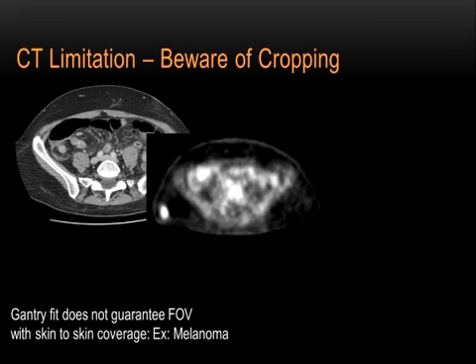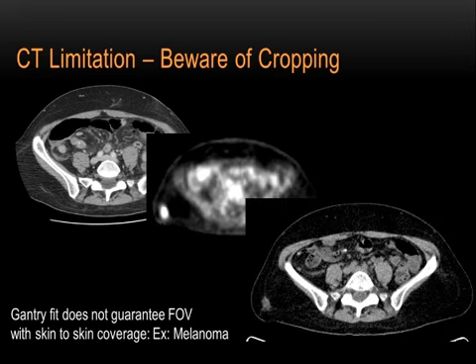Well, we basically went back and reconstructed the field of view, extended beyond what the technologists had done, and then we could see that metastasis on the CT also. So this was just a case where the technologists didn't fully extend the field of view, not realizing that this was a melanoma case. But oftentimes you will realize that specifically in patients who are really large, you may not have the luxury of getting this area, right? So this is one of the limitations of the modality.